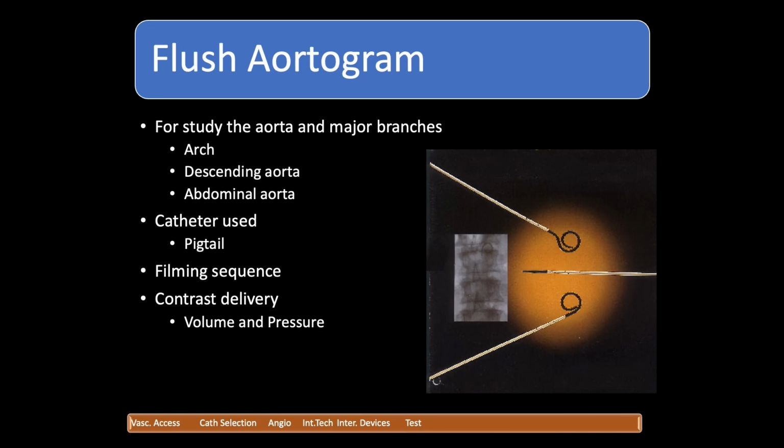And the pressure in that area is also high. So the rate and force of injection should be higher. 800 psi pressure you have to give at a rate of 18 ml per second. So 18 ml per second is being delivered, and within only 2 seconds that much volume of 40 ml can be delivered there. Understand?